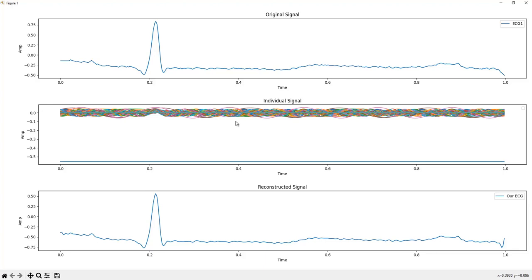But if you have a periodical signal like the ECG, in each heartbeat we have the periodical signal with the same pattern, so if we model one beat, then we can model every beat. Yes, because the Fourier series can model one period, not the whole of this period. Okay? Do you understand this notion?